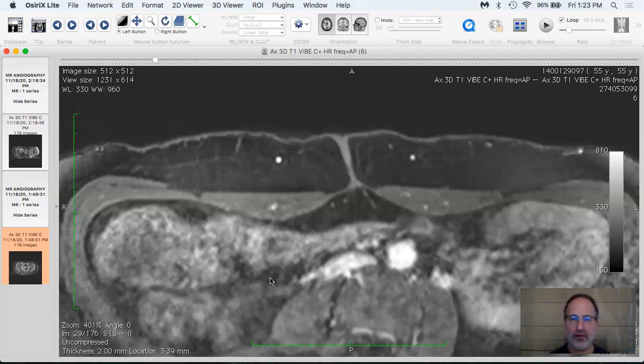Prior to imaging for perforator flap breast reconstruction, we only had the handheld Doppler, which allowed us to listen for a signal, and we could hear the blood vessels that we wanted to use potentially to transfer the tissue, but we didn't see them until we got into the operating room. And sometimes the sound or the signal that we hear from a blood vessel does not correlate directly with the quality of the blood vessel.